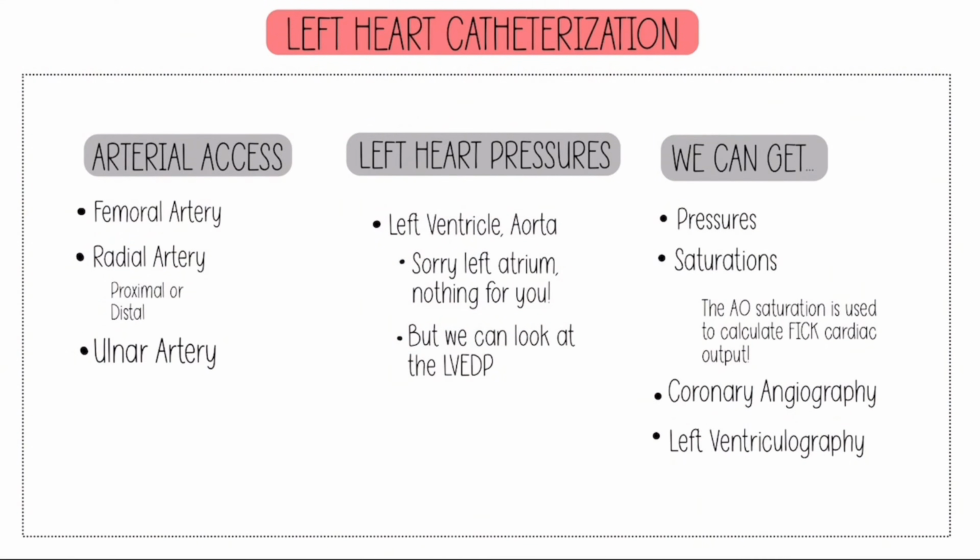So the way that we really go into the body, remember I said, is retrograde, meaning against normal blood flow. Let's say this is the femoral artery in the groin, for instance, I'm coming this way. This is the aorta.